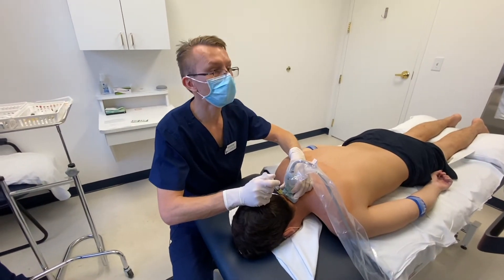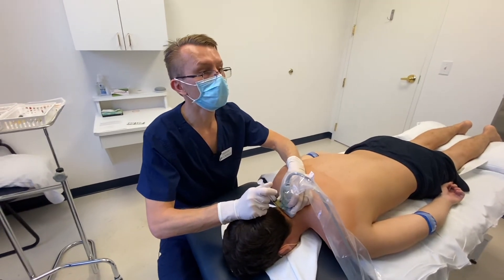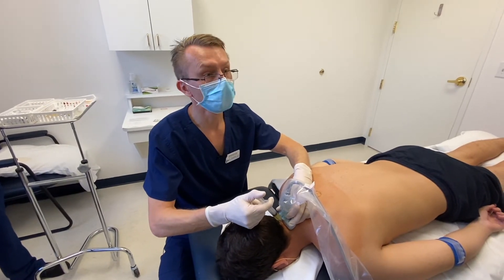I'm going to work on some of the midline structures now. We're going to get the spinous process and the nuchal ligament, which is such an important area to stabilize the cervical spine.